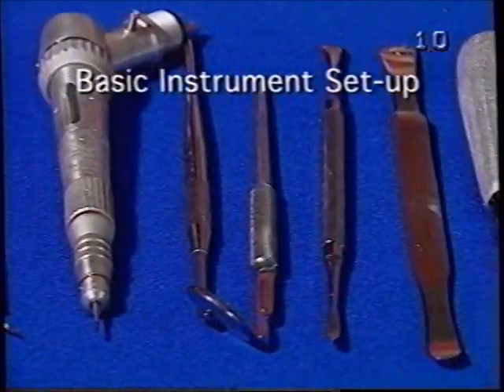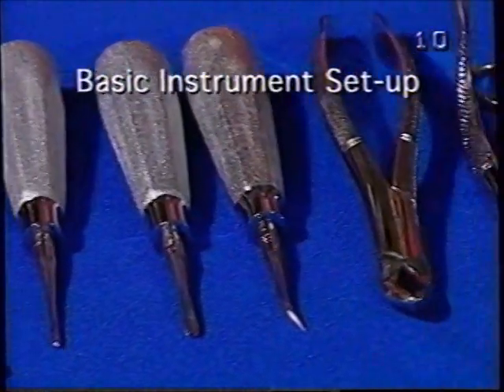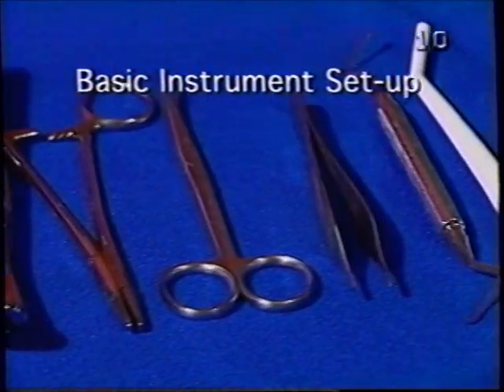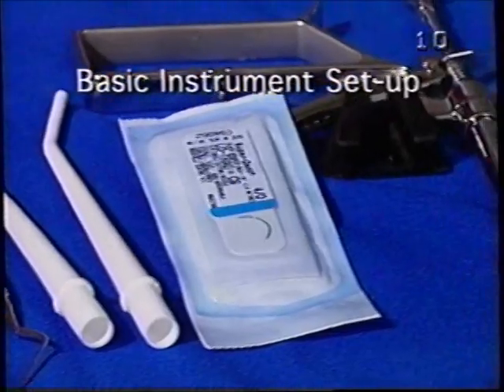Another thing that we have in the way of supplies are these sterile drapes. They come pre-packaged. They're approximately 18 by 26 inches. We use one over the patient, and then we use another one under the sterile surgical instruments. We talked about the basic supplies. These are the basic instruments, and I feel that for any of the extractions that have the potential for becoming surgical, we should have these in a tray setup. Most of these instruments are bagged, ready to go.